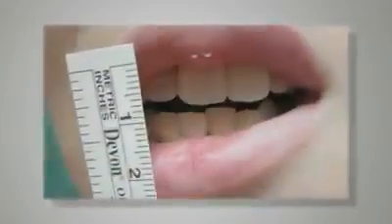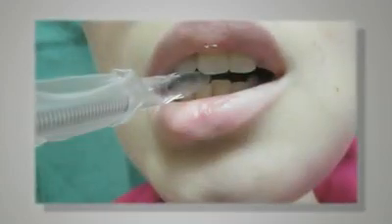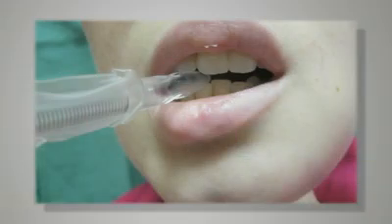Up to 38% of patients develop trismus following surgery and radiation therapy for head and neck cancers. An airway challenge arises when these patients require general anesthesia and passage of an endotracheal tube between the teeth is impossible. The option to secure the airway in this scenario is nasal intubation.